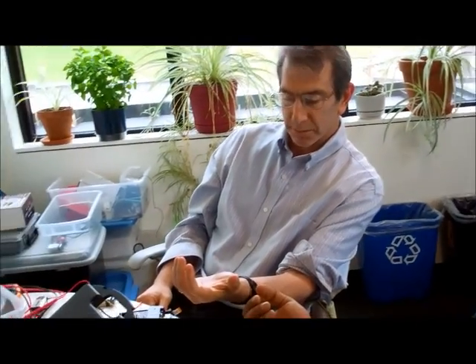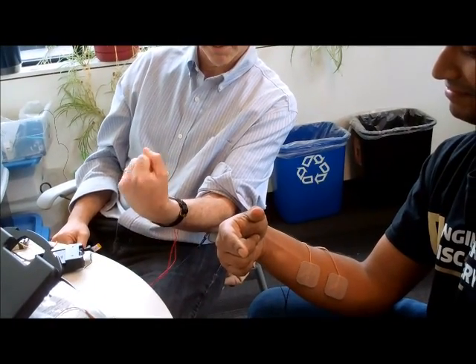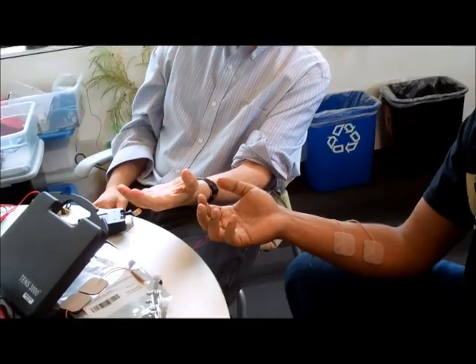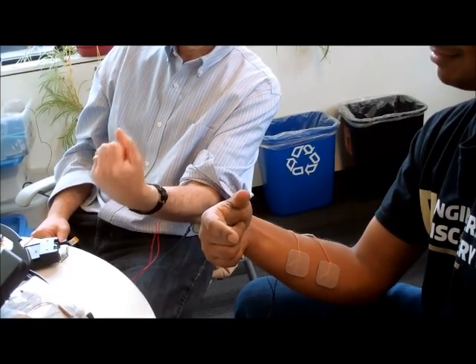Here I'm going to contract my muscle. His muscle contracted and now I'll let go. We'll do it one more time — contracting my muscle now. And there goes his muscle. And release. Thank you.